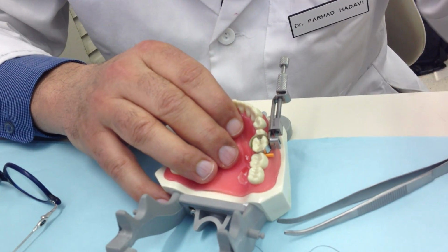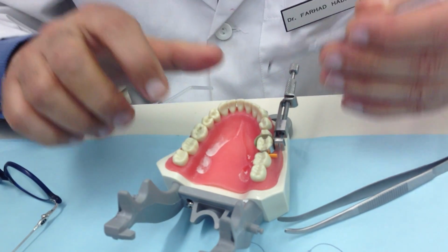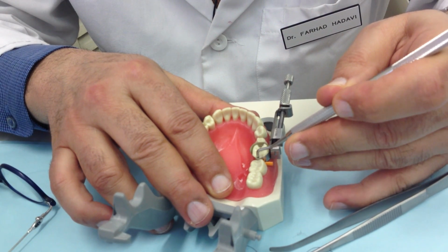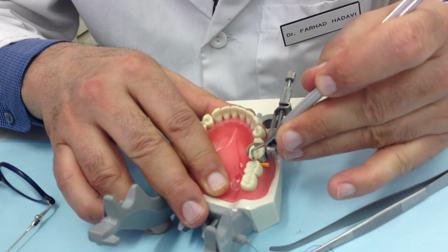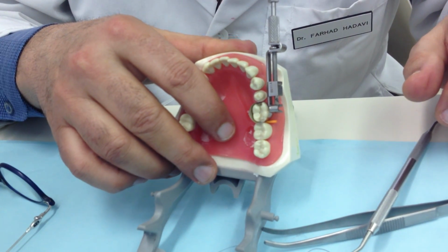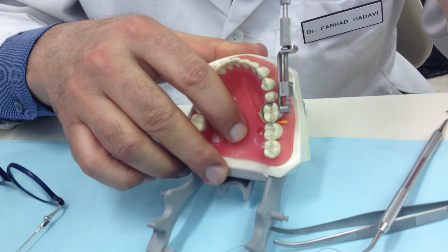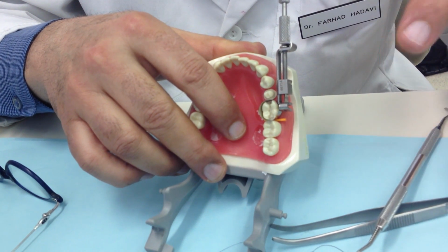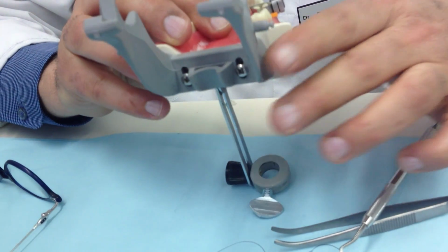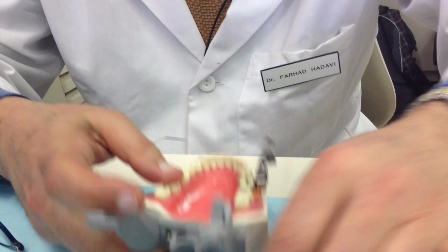The second thing that I do, you can see if I look at that one, this is convex. So I place the tip of that one on the gingival floor, and I go over here and burnish to the adjacent tooth. When I burnish it, I don't know if you can see, on the matrix band, I can see a dimple right at the contact area, correct? And now I'm ready to place my amalgam restoration here, correct?